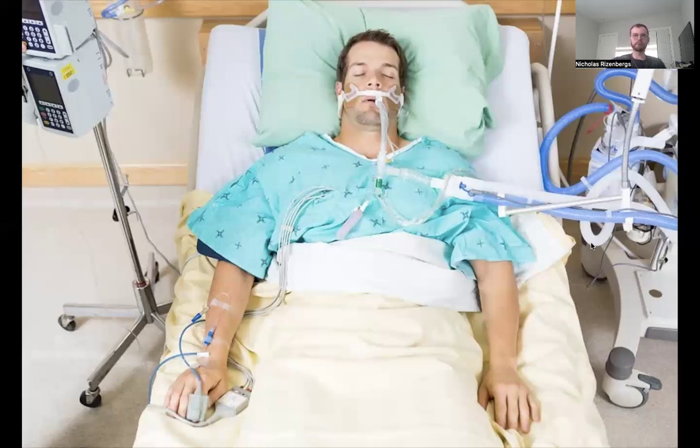So after the weaning trial, to keep Mr. Rudd from failing an extubation, first off, during the extubation, I want to make sure that I tell him my process, what we're going through, and that I need him to cough and when to do that and to continue to cough. So I'll tell him I'm going to count down from 3 to 1, and then I'm going to say cough, cough, cough, and I want you to continue to cough and not swallow, and I'm going to suction out your airway. And the reason I want to do that is because I don't want him to swallow any of those secretions that could go into his lungs and cause him to have that ventilator-associated pneumonia, or even aspirate, which either one is inevitably probably going to put us right back on the vent. So that's a big point in that process.